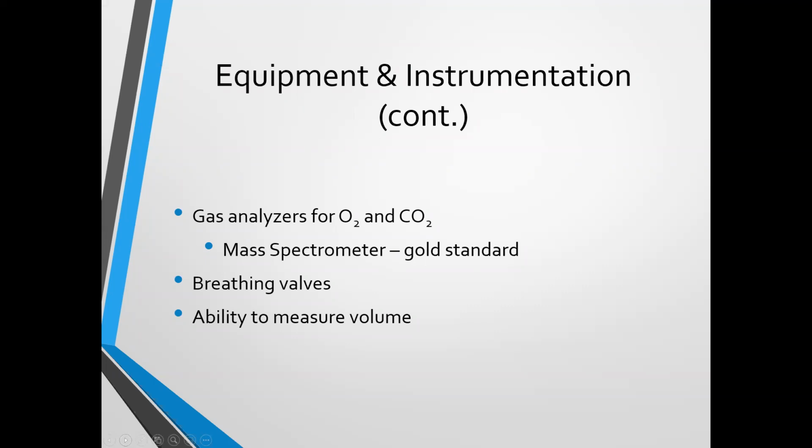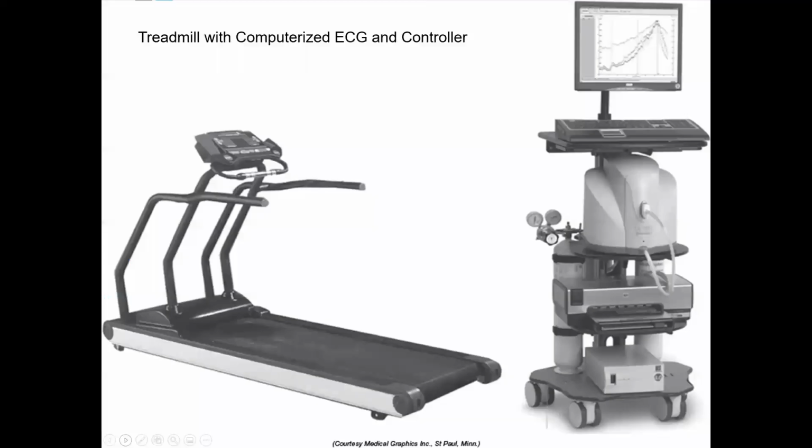Breathing valves, and then the ability to measure volume. The image that I showed you on the greeting slide had the individual with a mouthpiece or a mask on, measuring volume, but also measuring the oxygen and CO2 content of the gas that the patient is breathing in and exhaling. And again, just a little depiction here: treadmill, computerized ECG controller. It's also recording, etc.